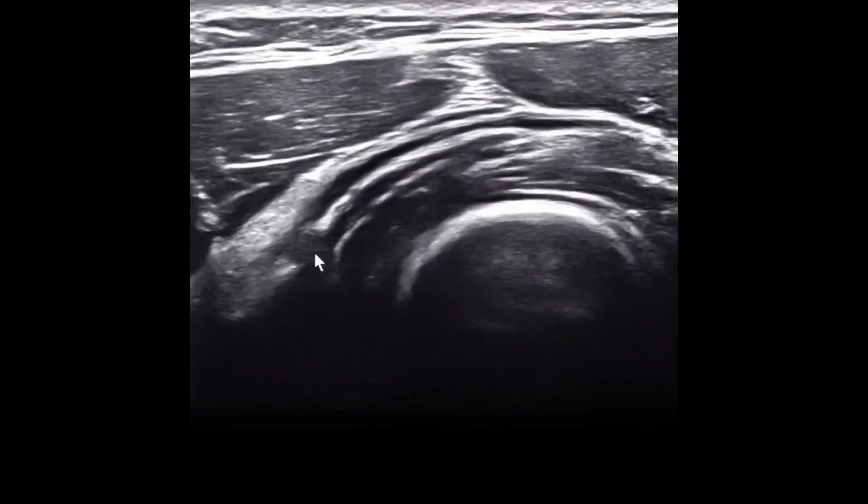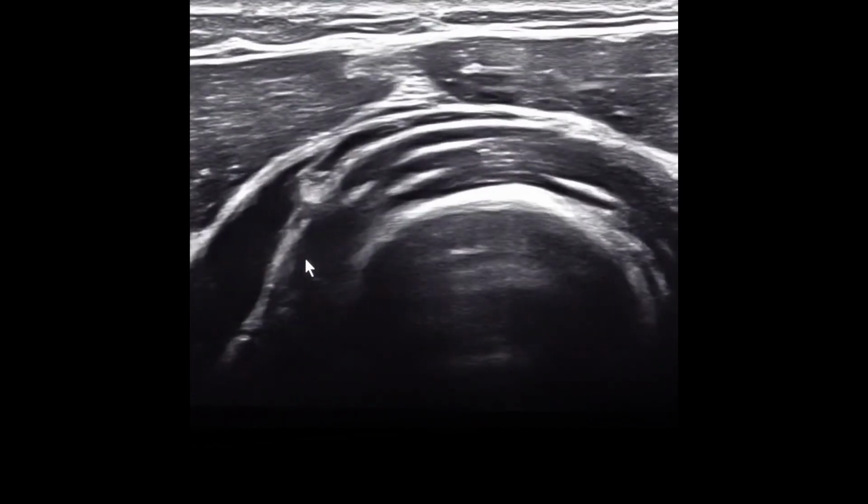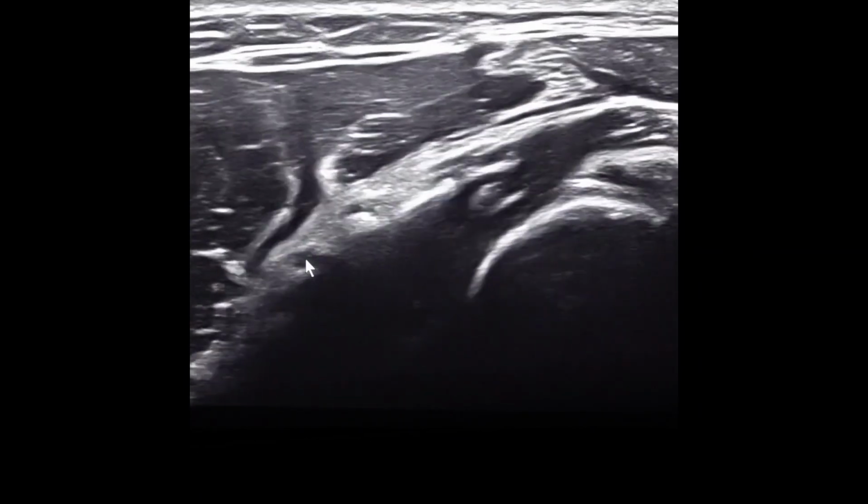So this is a common problem, easy to find with ultrasound if you have experience, mimics lateral elbow pain.